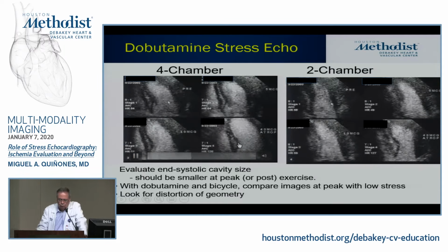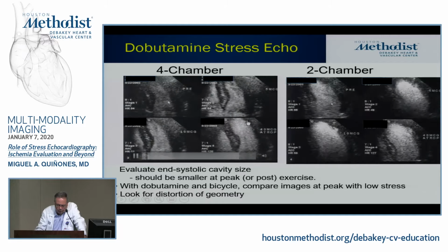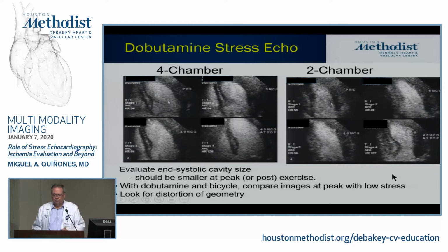And then, of course, once we have detected that, we spend time going through every segment, and we can see that there's no thickening happening anywhere here, all the way up to here. Maybe there's a little bit of thickening beginning to happen right here. So this is a very prominent LAD abnormality, and amen. So this was a nice dobutamine.